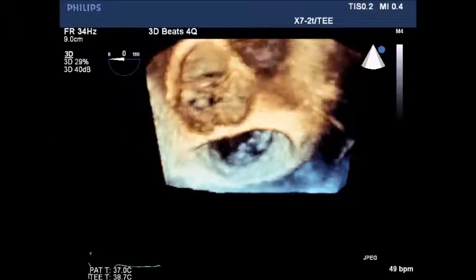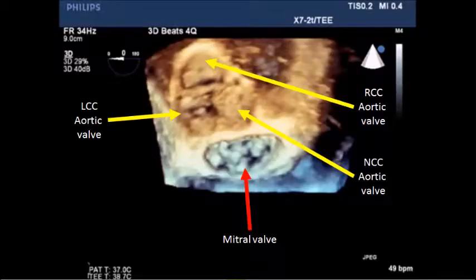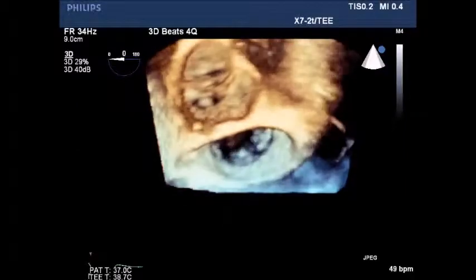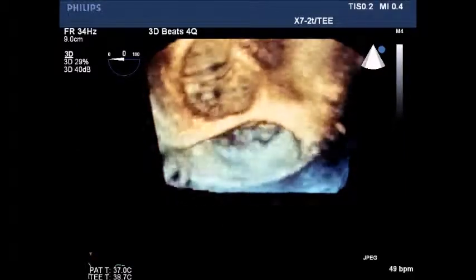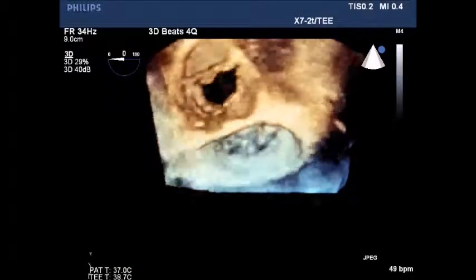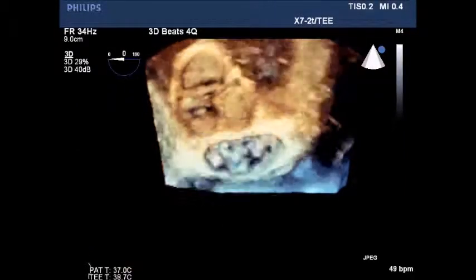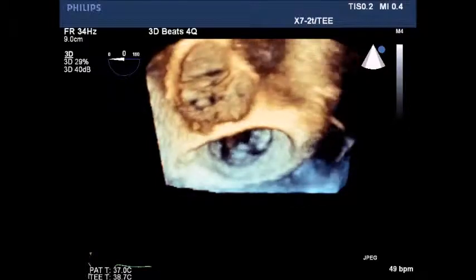Note the aortic valve: the right coronary cusp is at the top, the left coronary cusp is at the left, the non-coronary cusp is at the right, and the mitral valve is at the bottom. Normal functioning aortic valve.